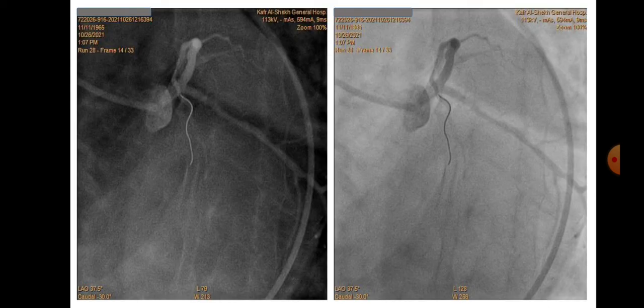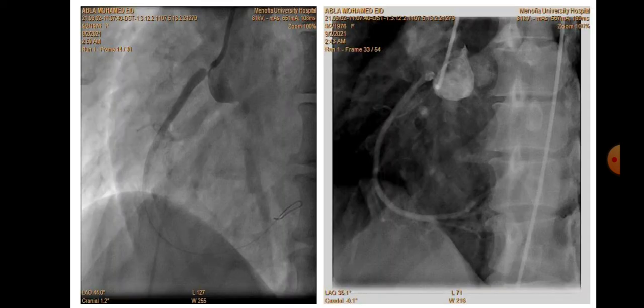This is exactly what I did. If you look exactly at the ostial LAD, the proximal stent struts are exactly at the beginning of the LAD, and the ostial LAD is not diseased. So I think it was very helpful to use this inverted grayscale.